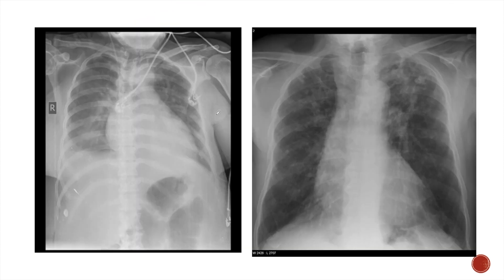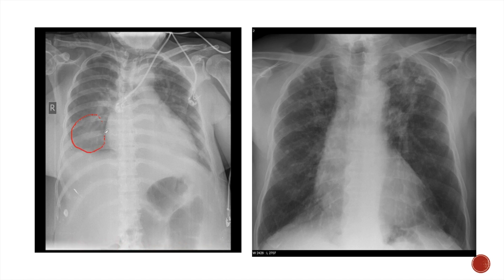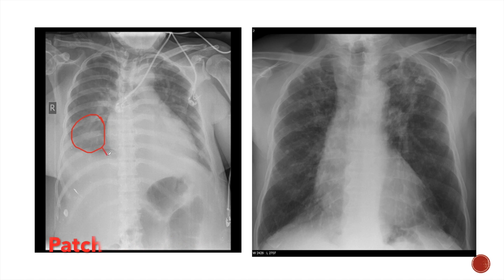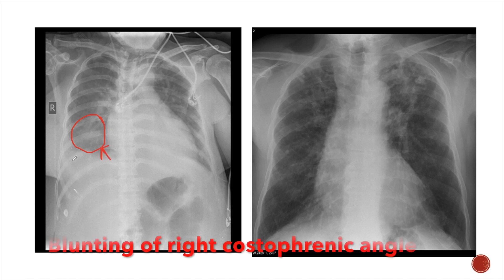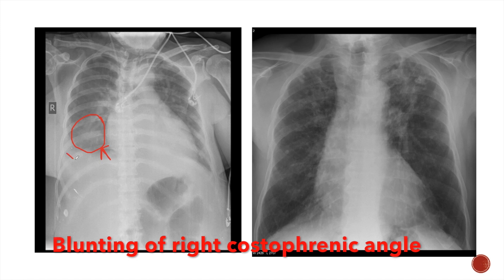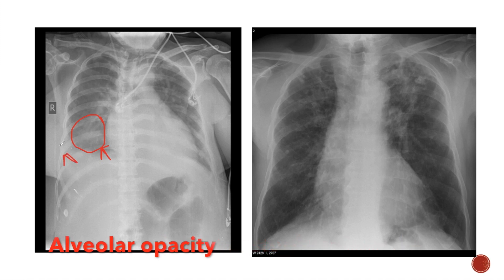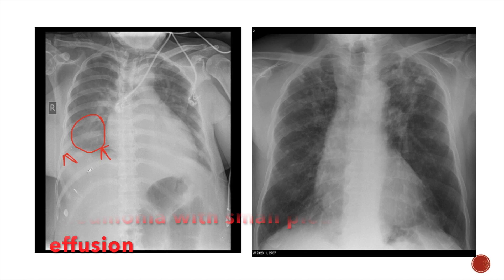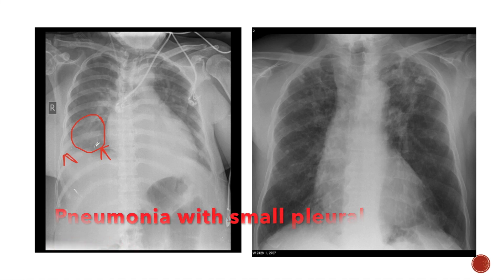Now take examples of these opacities. In the first X-ray we can see an opacity in the right lower zone. This opacity is unilateral and tends to coalesce, forming a patch. It is associated with blunting of the right costophrenic angle. This is an alveolar opacity, so this is a case of pneumonia with a small right-sided pleural effusion.